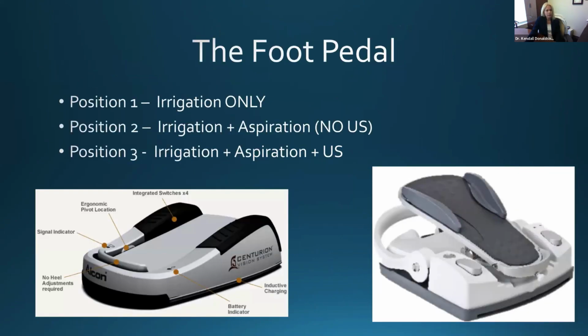And here's our foot pedal again. I mentioned the 3 positions. We want to make sure that we're going to be efficient, not going into position 3 until we really need it, okay? So we don't want to release any ultrasound unless we should be in position 3. So we want to use that position the least amount possible.